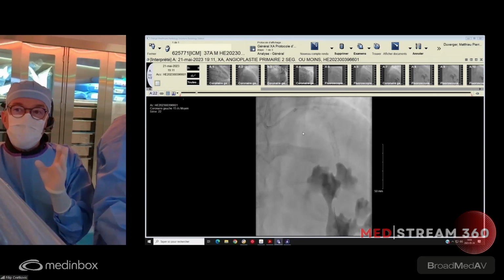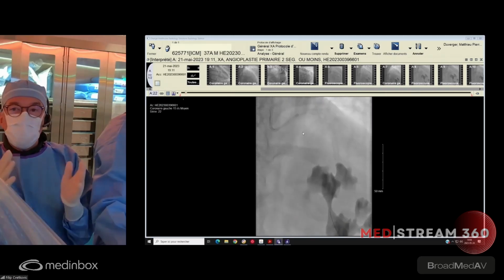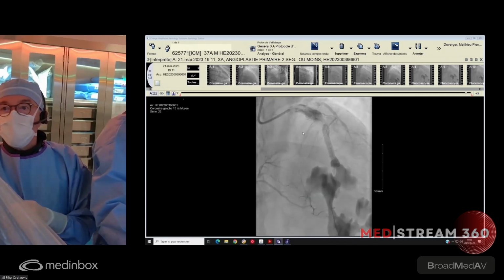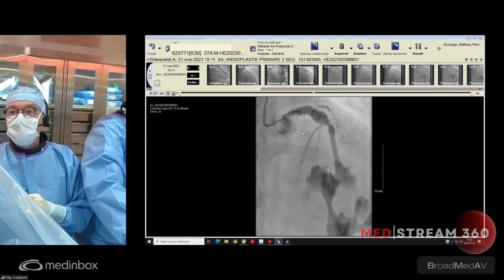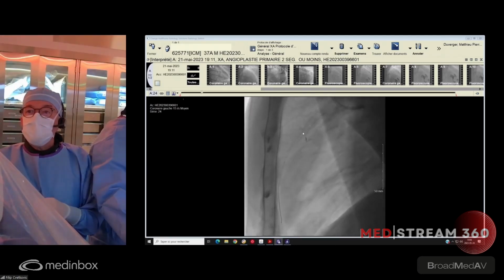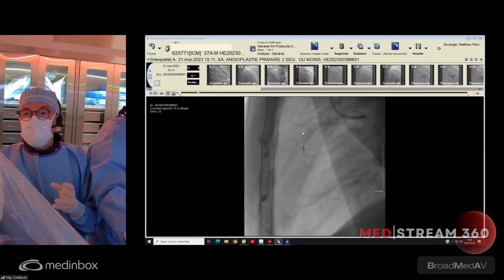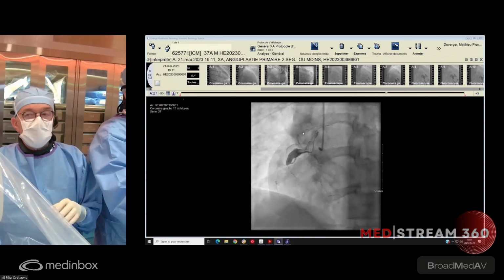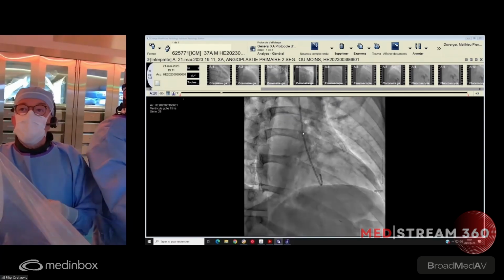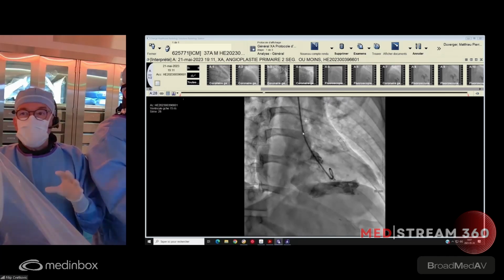A stent was placed, and because of the dimension, a Megatron from Boston Scientific was selected that could grow up to 6 millimeter. It was a 4.0 by 20 millimeter that was deployed there. The stent has been implanted. The flow is not normal, but it's much better than at the beginning. After the 4.0 stent, a 4.5 balloon up to 18 atmospheres was deployed. Then finally, because the patient was stable, a V-gram was done. You could see some severe anterolateral, apical, and even inferior involvement. So this is the angiogram of Saturday evening.